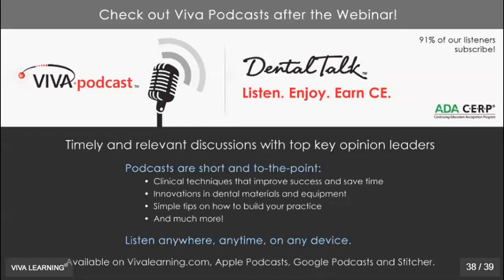Next question is from an RDH. Stephanie says at some offices that she is temping in, they also use rubbing alcohol to wipe instruments. Despite the risk of an occupational injury, she was taught in dental school that rubbing alcohol actually makes the bacteria adhere to the instruments or other hard surfaces. Is this true? Stephanie, you are indeed correct that alcohol can act as a fixative. That means it makes debris and bioburden adhere to the surface. So that is indeed true.